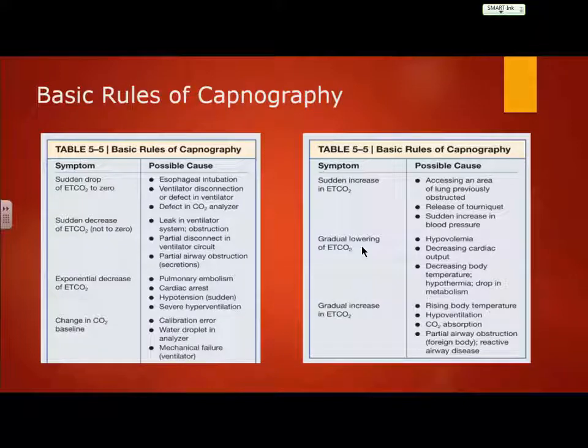Check the patient. Check your ET tube, because what may have happened is that it's become dislodged, and now we've got an esophageal intubation. So what are we going to do?